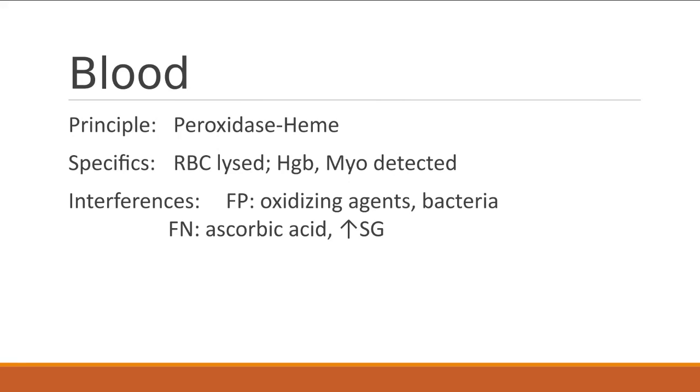And that makes a difference, because to know what's wrong with the patient, you are going to have to look at the microscopic, which you have to do if anything is abnormal in a urinalysis. But if you look at a patient who has a positive blood chem strip, you don't necessarily have to have red blood cells showing. You may not see red blood cells under the scope because they're lysed. When they're lysed, it can cause your urine to be kind of red.